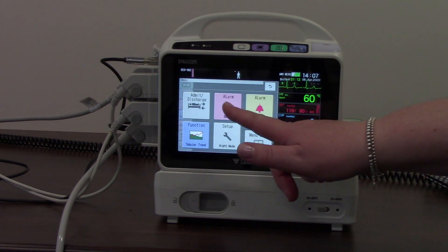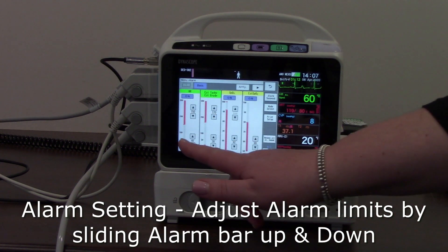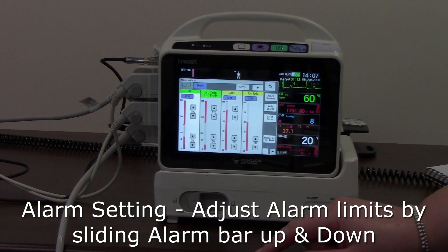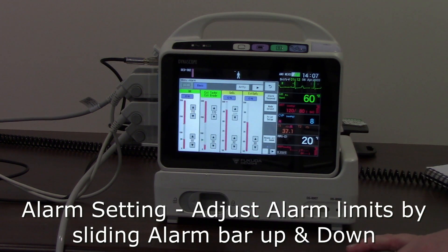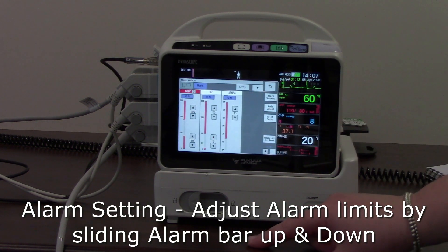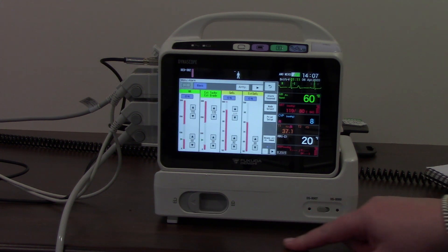We've also got our alarm setup menu here. I can adjust any alarms by dragging and dropping to where I want the alarm upper or lower limit to be, or using the arrow keys. I can work my way along each parameter, and there's also a next page so I'm able to set all of my alarms in the monitor.